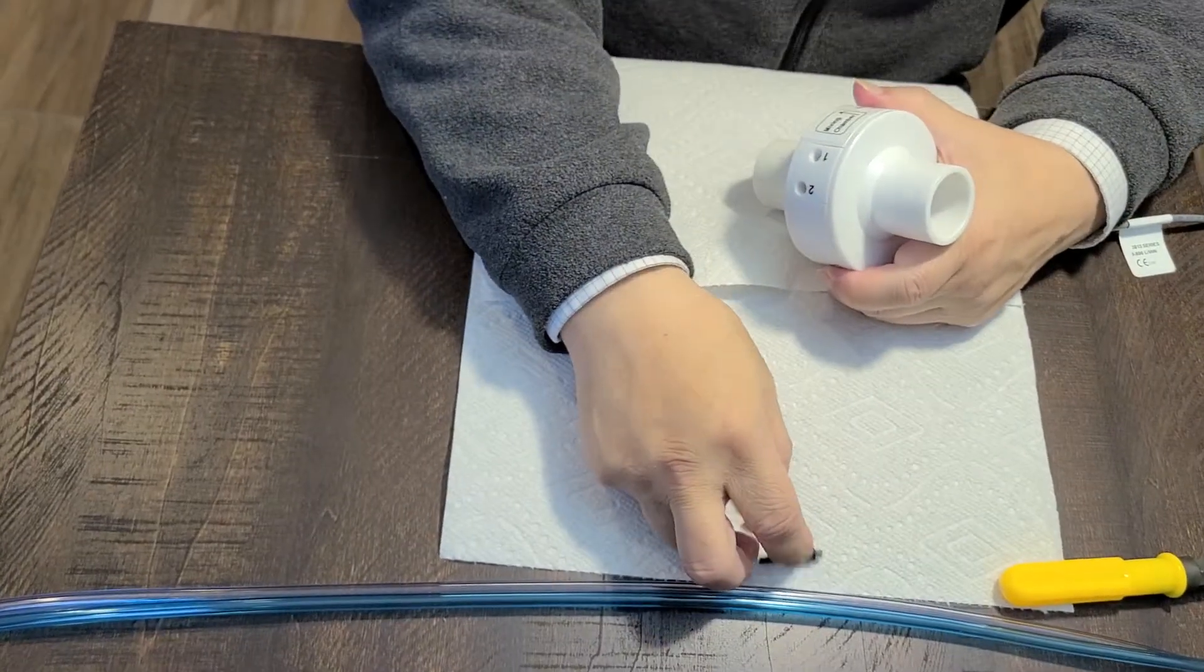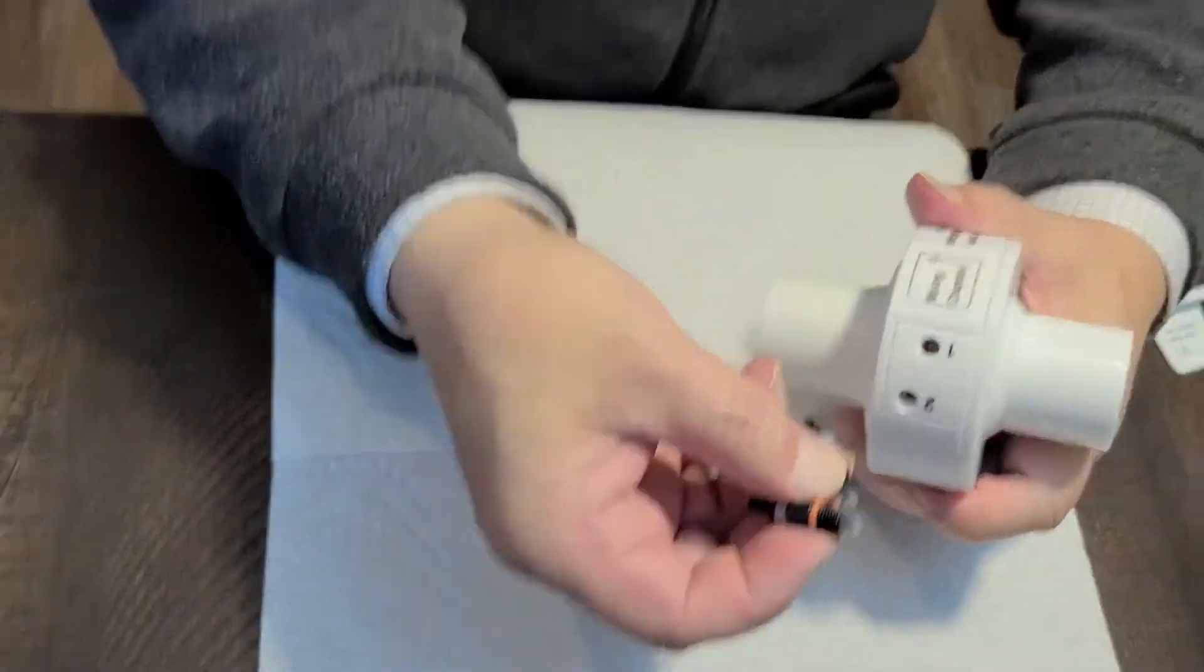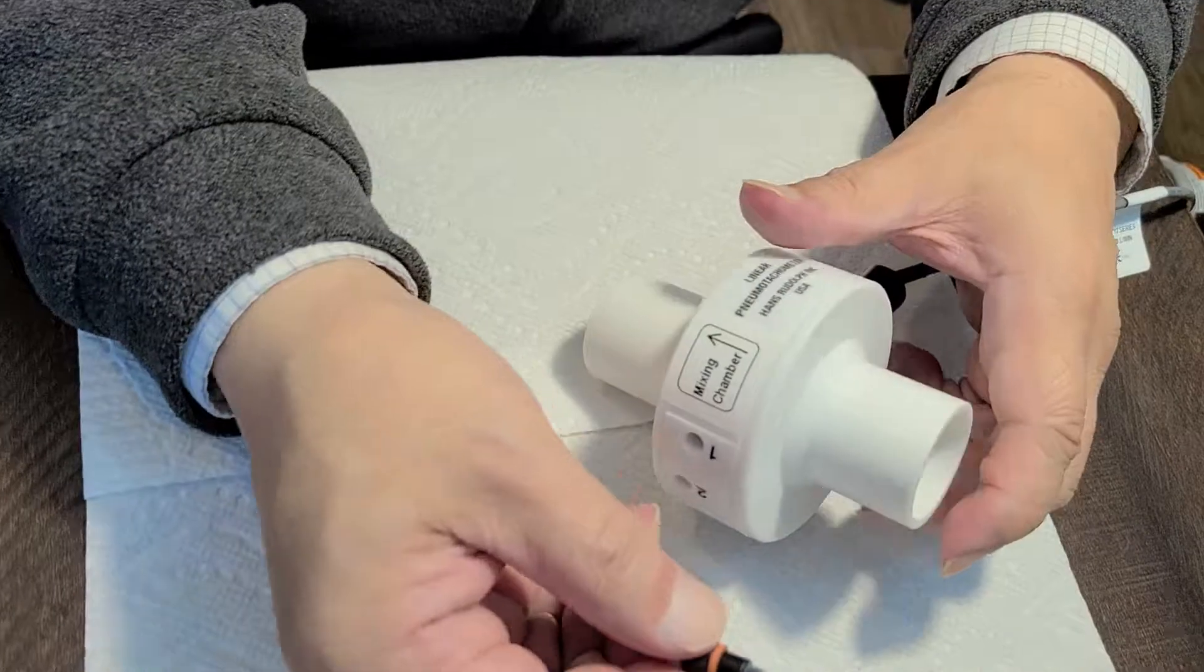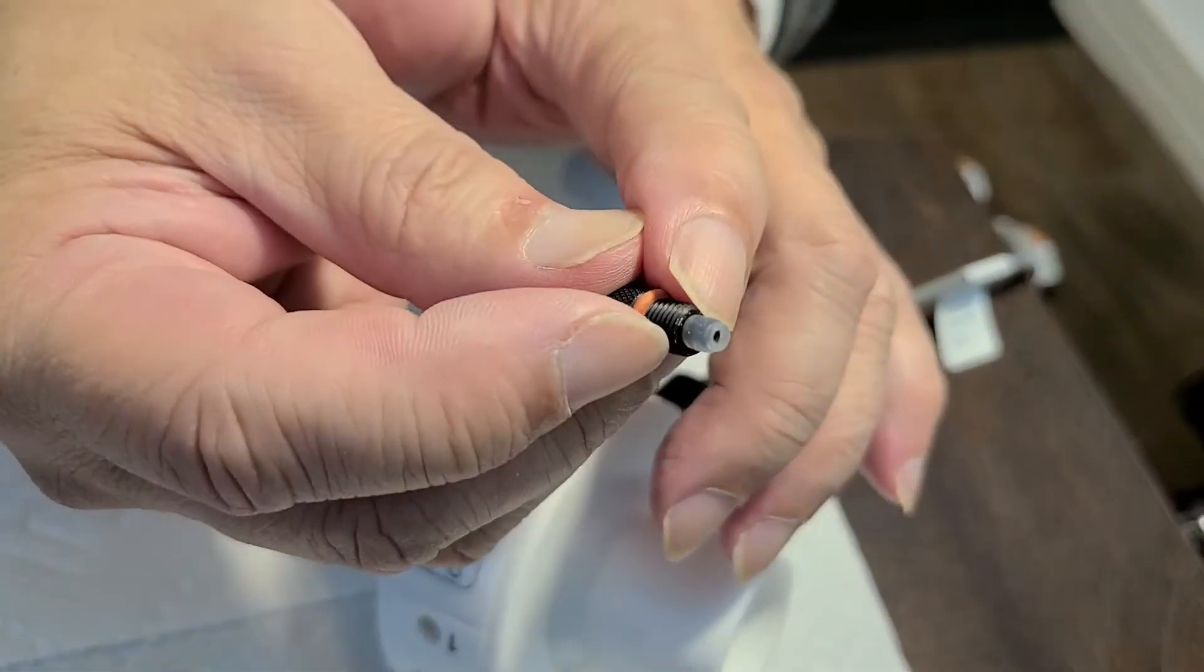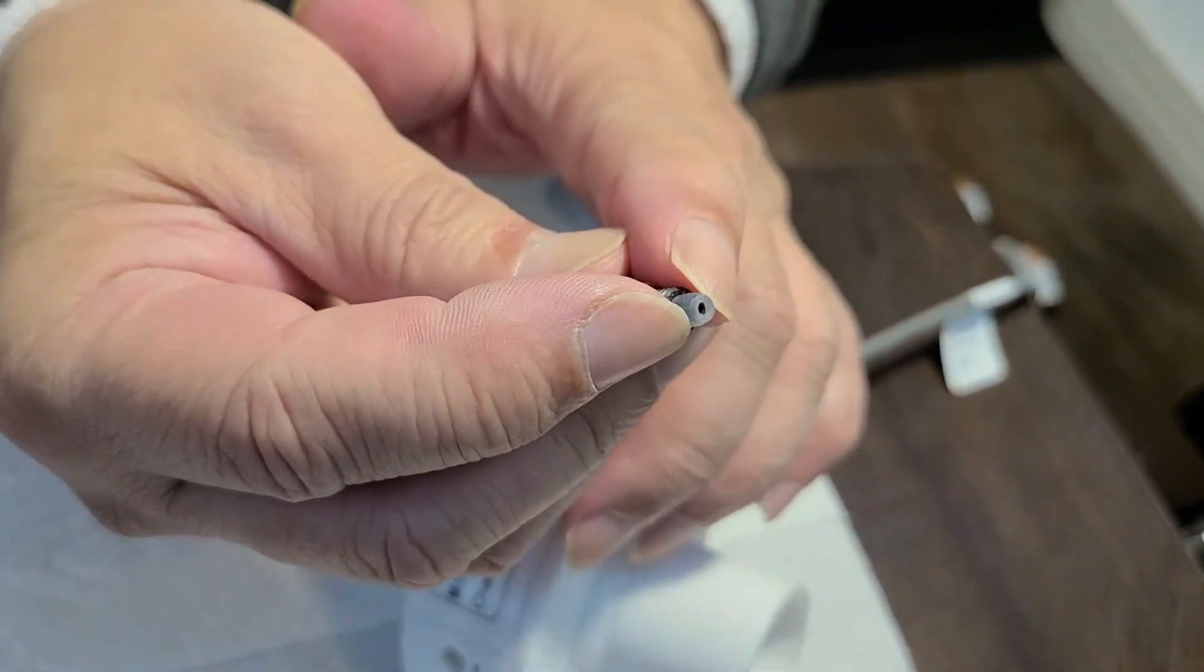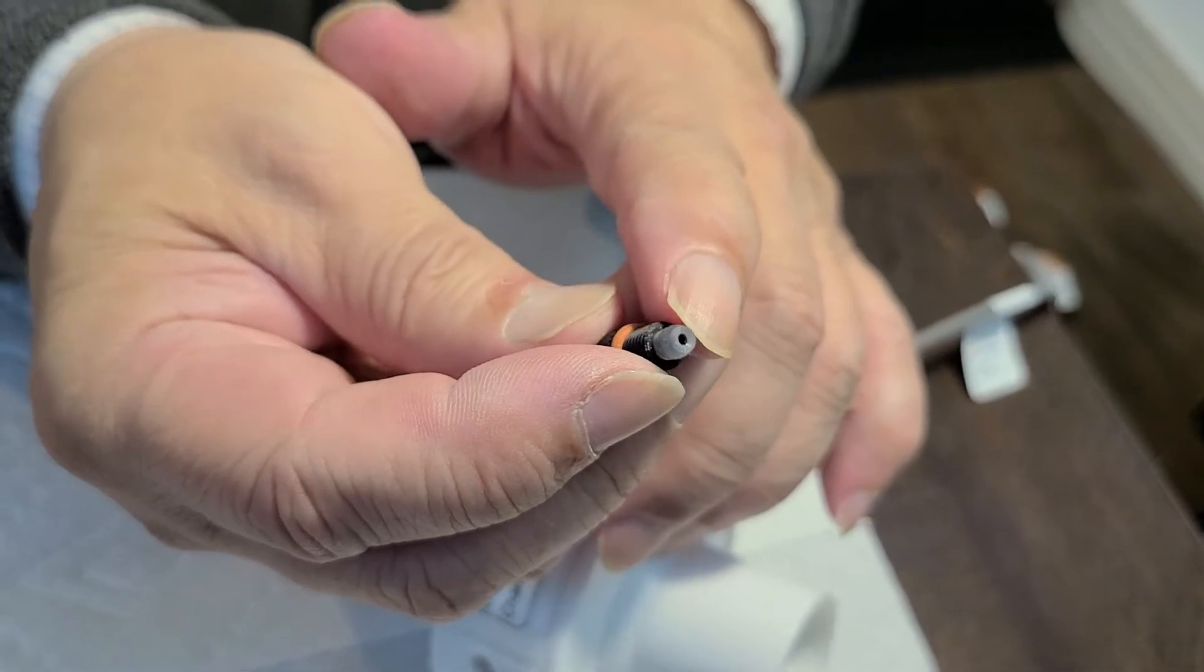Now, next step is put the black connector back in. Black connector has a tiny silicone seal that has a protruding portion.